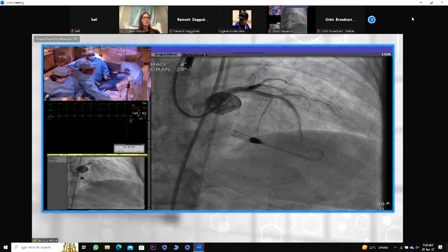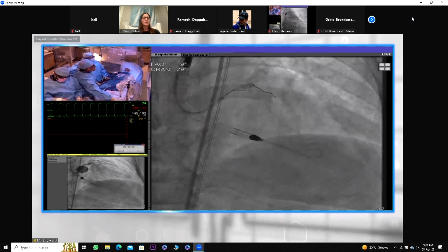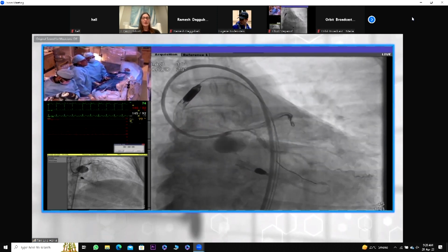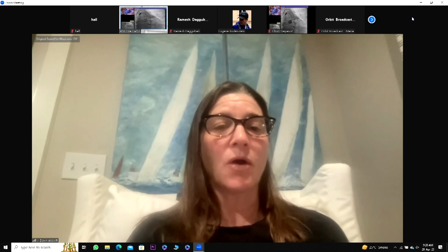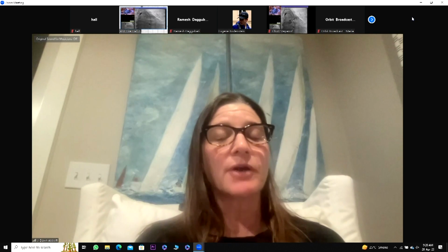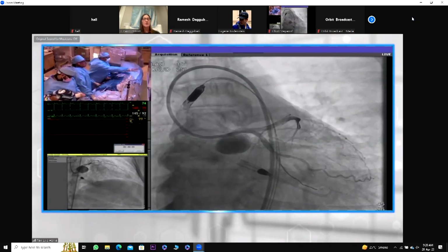So that was actually one of the reasons I asked you questions in this case as well. Dr. Ramesh, any final comments from you? I think he had to run and get a call. Okay, but thank you. I do think most of the steps of the DK crush can be done with no contrast.